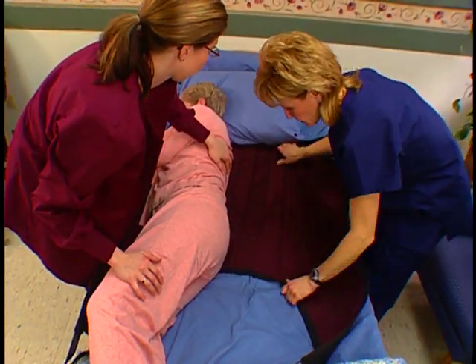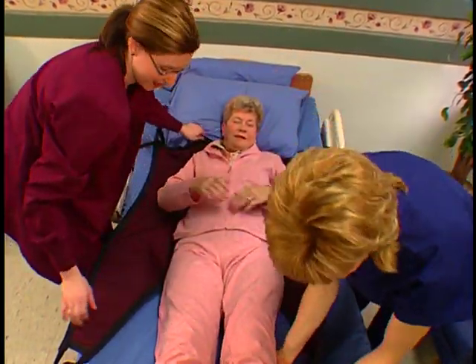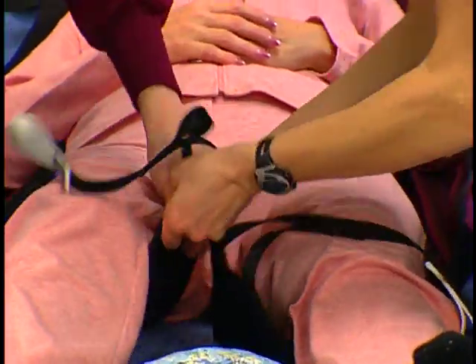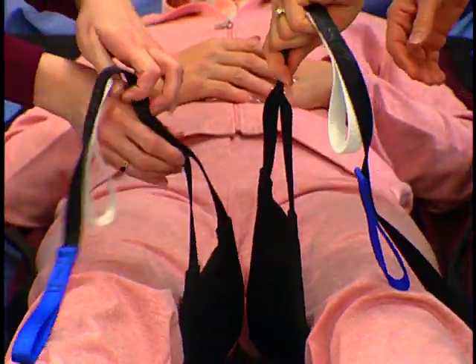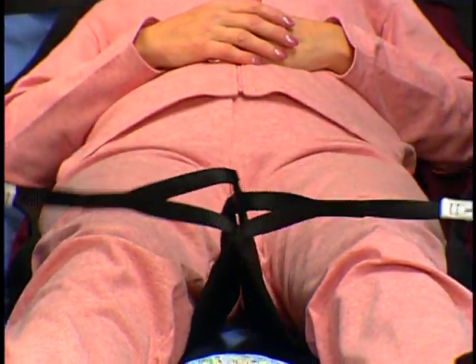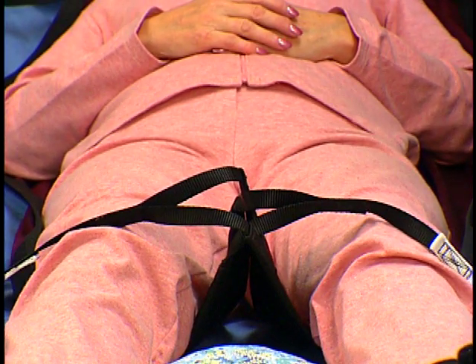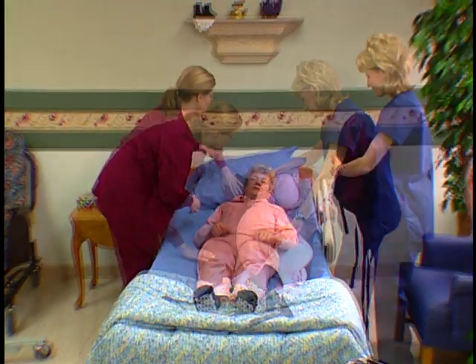Roll the resident to the other side, pulling the top portion of the sling out. Smooth out any wrinkles. Move the resident's legs apart slightly and bring the sling material under and between the legs. Thread either leg strap with color-coded loops through the opening at the bottom of the opposite leg strap. Straps will now be crisscrossed. You are now ready to transfer. To remove the sling, simply reverse the previous steps of placing the sling.